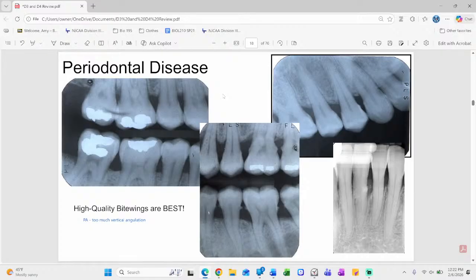Claire gives a thumbs down. You have to be smarter than the computer. Yeah, I have to be smarter. It may pick up something from a different angle, perhaps your eye didn't catch, and then once you take a look at it, but it doesn't catch everything. It does not. It's a tool.